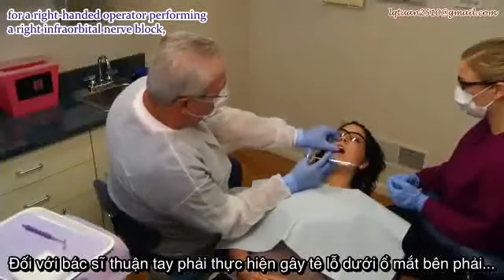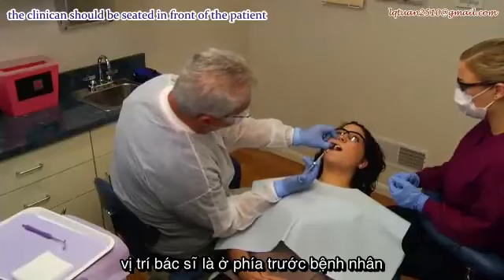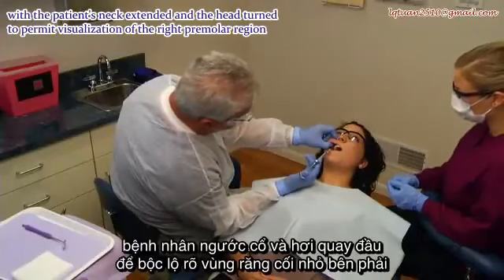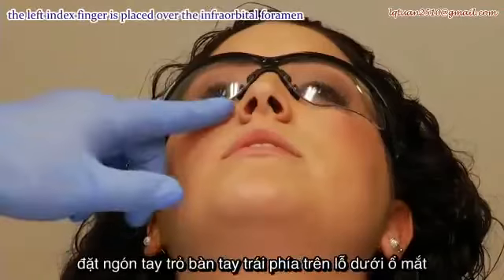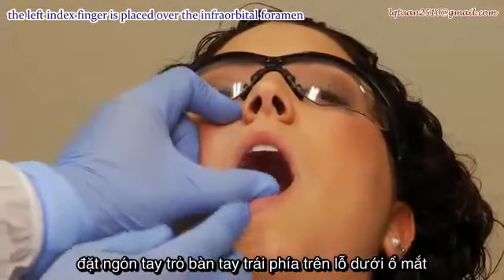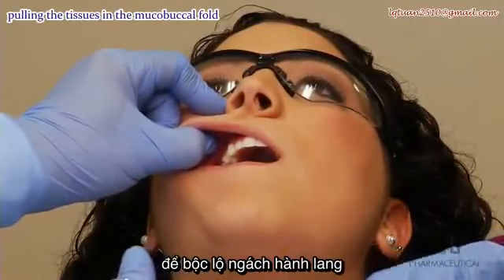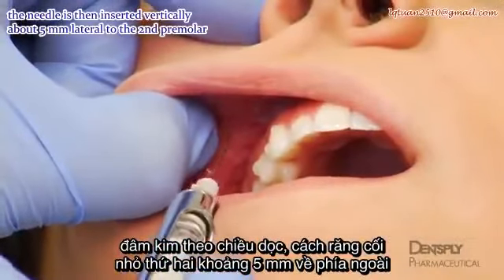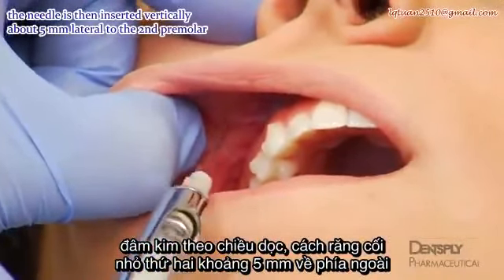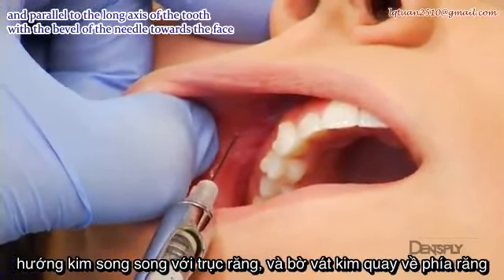For a right-handed operator performing a right infraorbital nerve block, the clinician should be seated in front of the patient with the patient's neck extended and the head turned to permit visualization of the right premolar region. The mouth may remain closed. The left index finger is placed over the infraorbital foramen and the upper lip is retracted by the thumb, pulling taut the tissues in the mucobuccal fold. The needle is then inserted vertically about 5 millimeters lateral to the second premolar and parallel to the long axis of the tooth with the bevel of the needle towards the face.